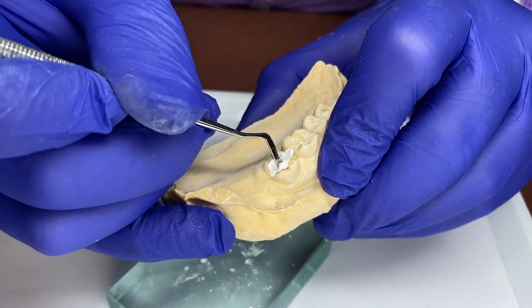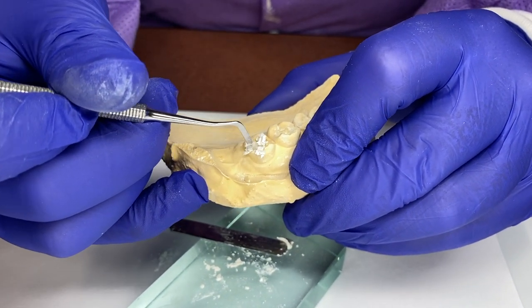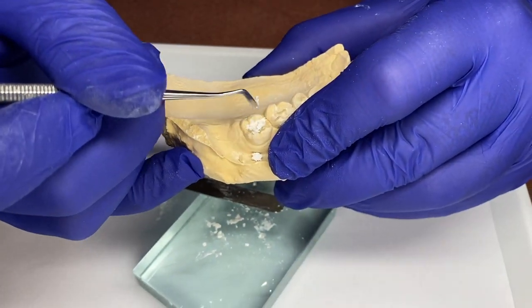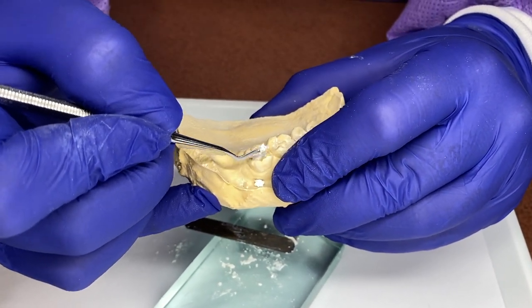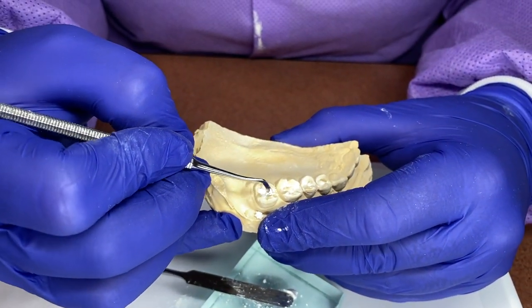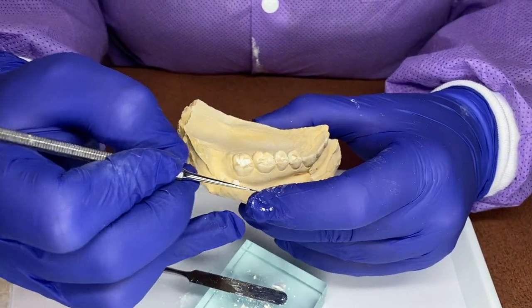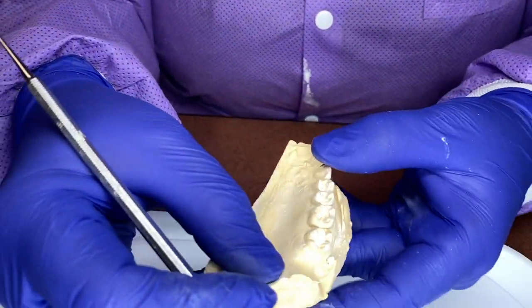Going to just take it. We want to push it down so the material stays inside the prep site. Wipe off any excess with the other end. We want to make it concave so that when the bottom tooth bites down, they won't have anything to bite down onto, so they're not going to hit too hard and cause any kind of trauma to this tooth. I'm just going to remove that here. There we go. Use your finger, make sure it's smooth, and there we go.